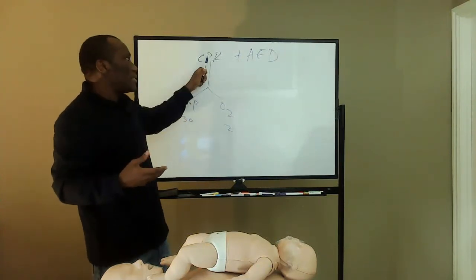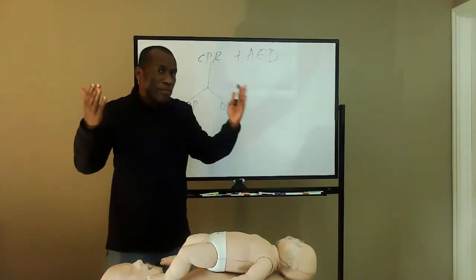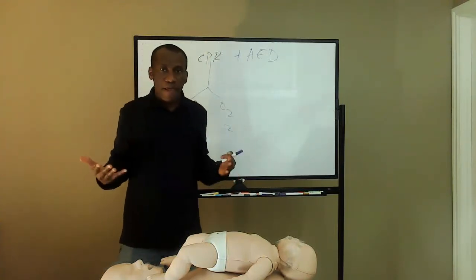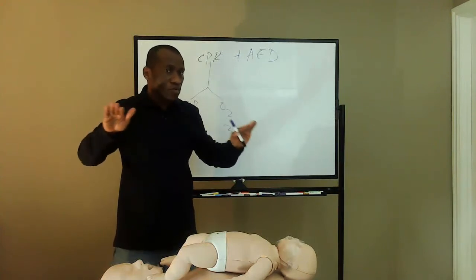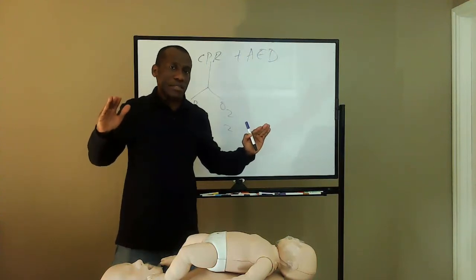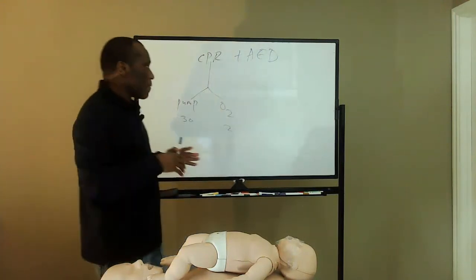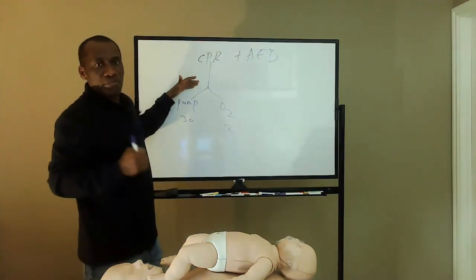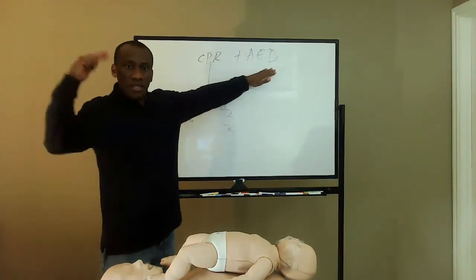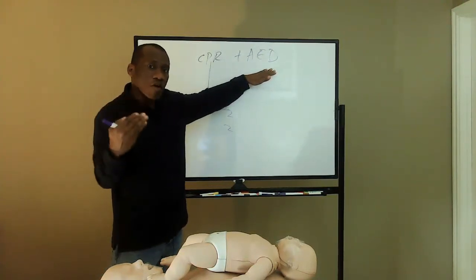Okay, so that's where CPR is important. Each of them is contributing a different purpose toward the overall goal, which is resuscitation. They play individual roles, very important roles. One is doing this, the other one is doing that. CPR is pushing the blood, bringing in oxygen, while the AED would detect what is wrong and recommend a shock.